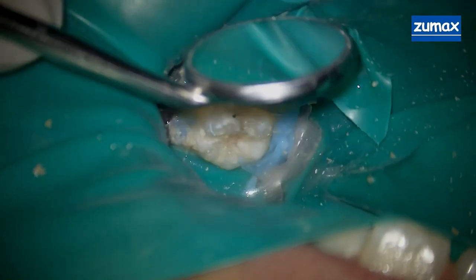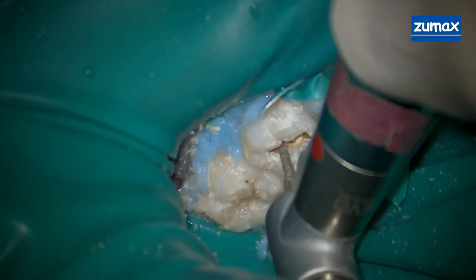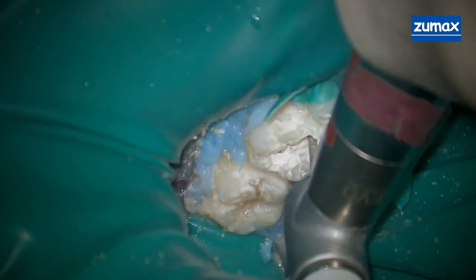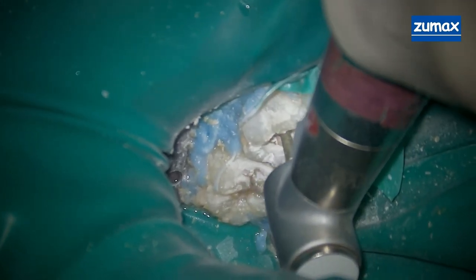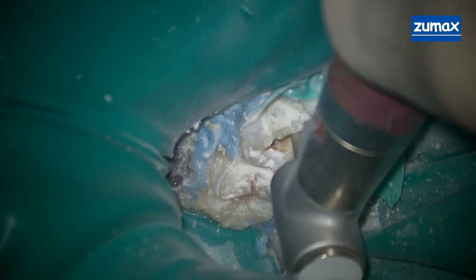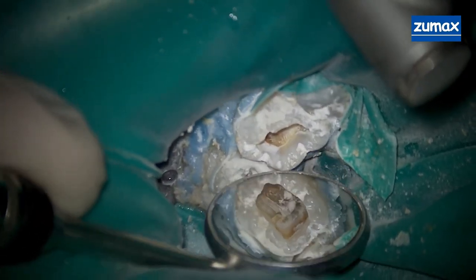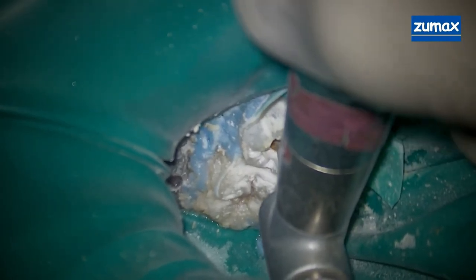In this case the caries were very extensive and because of that we had a lot of overhanging enamel. What you're seeing me do here is use a crown cutting burr — just a coarse diamond — to remove all of that overhanging enamel to increase my visibility and working area, just to make the case easier to work with so I can continue removing caries.